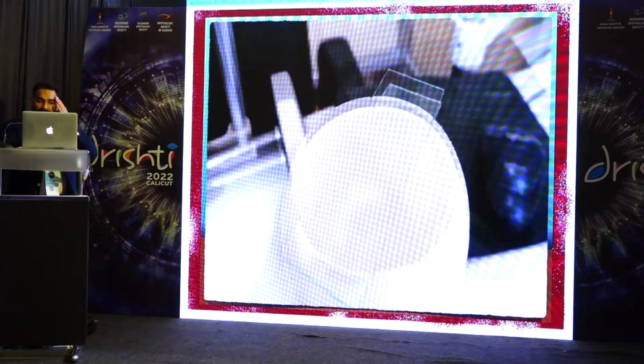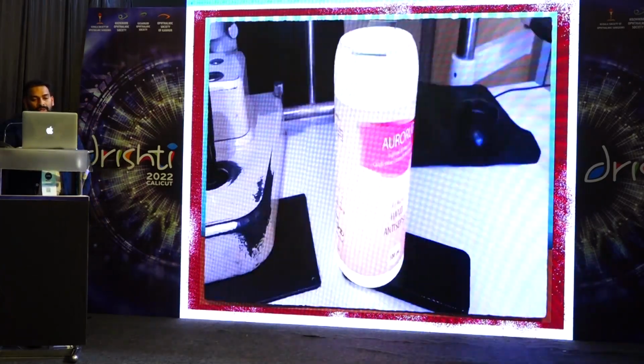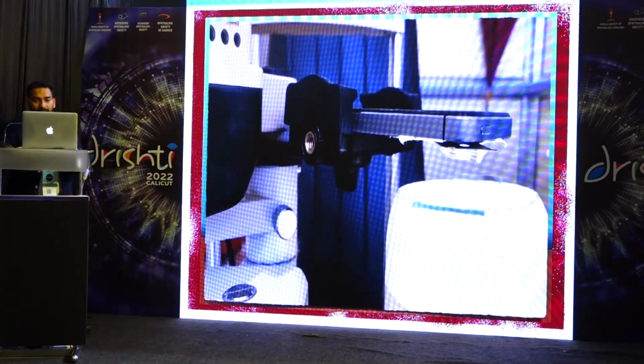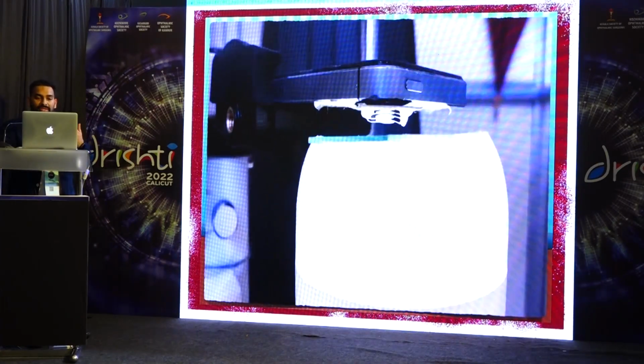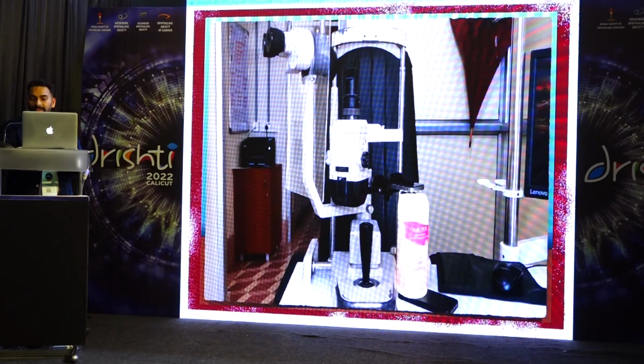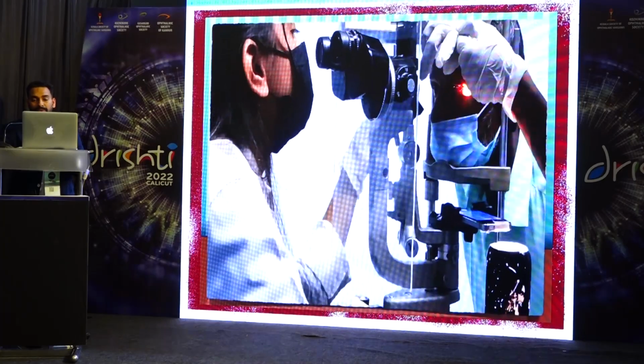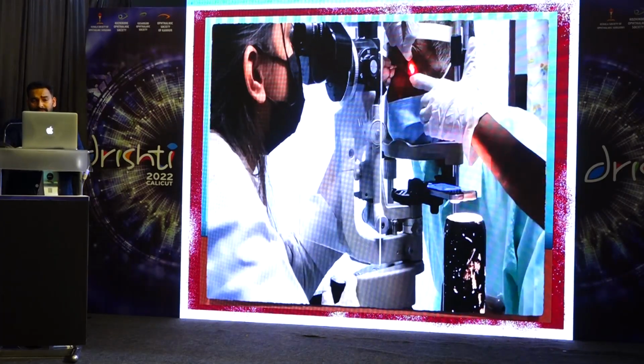Now you can either keep an illumination torch from a phone or a handheld torch. You can take corneal scrapings and look for fungus right there at the OPD itself. With the attachment to the slit lamp, it becomes easier. The phone doesn't shake.